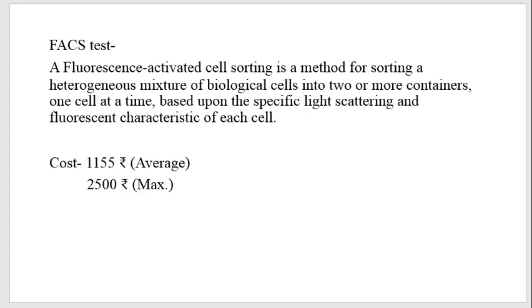So tagged WBCs can be easily found with fluorescence reflectance, as well as platelets, and then depending upon positive or negative voltage applied at the plate, the cells change their path in the flow, and that's how they get sorted, and further they are counted through either an optical method or an electrical method.